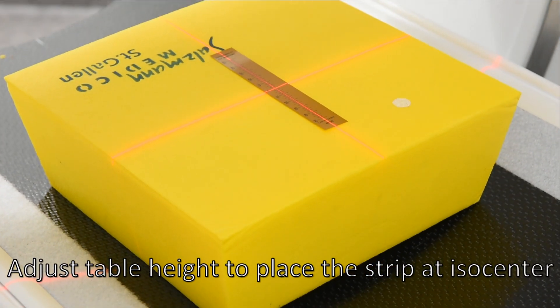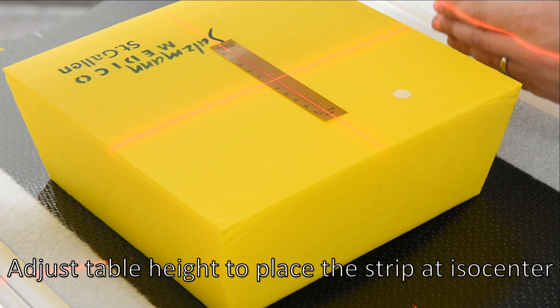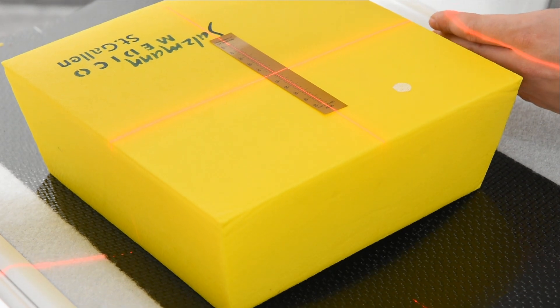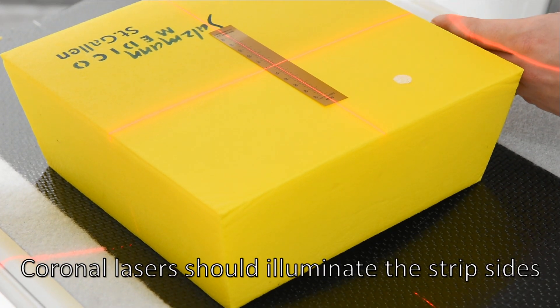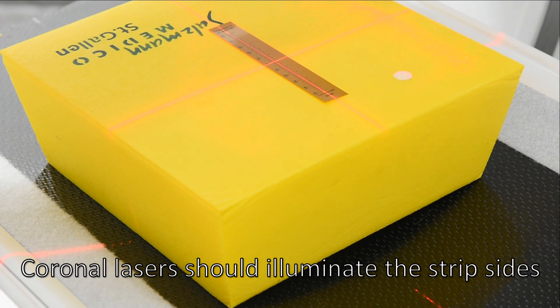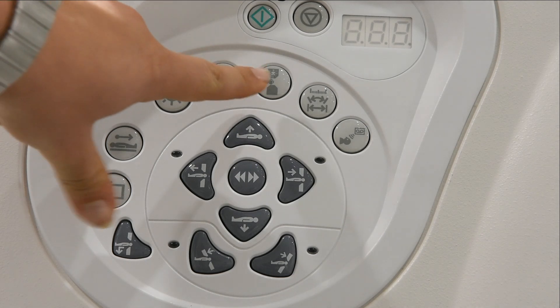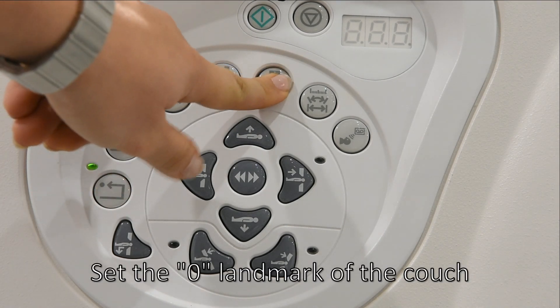Adjust table height to place the strip at isocenter. Coronal lasers should illuminate the strip sides. Set the zero landmark of the couch.